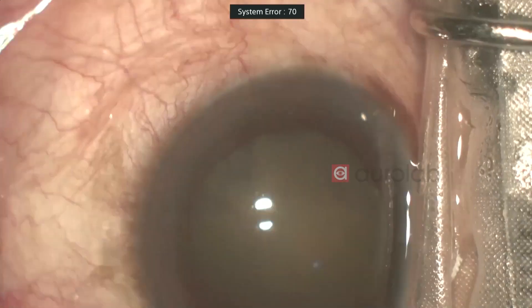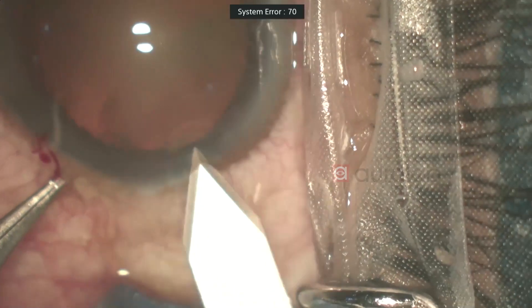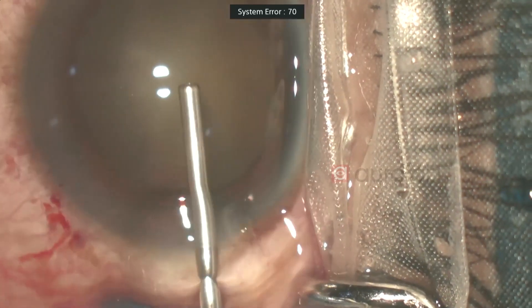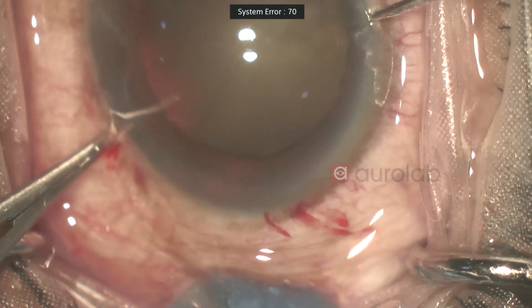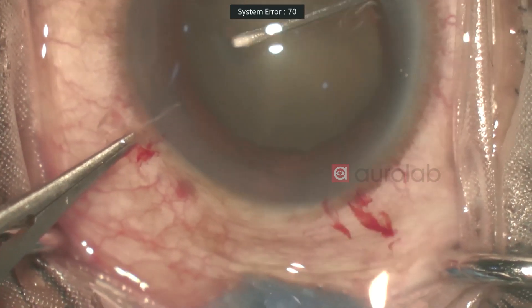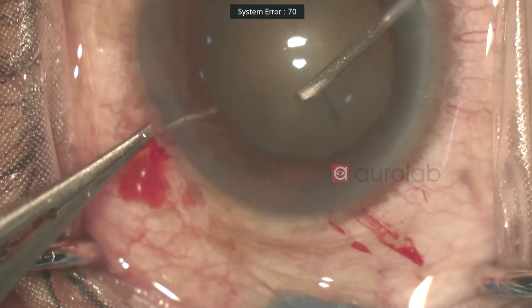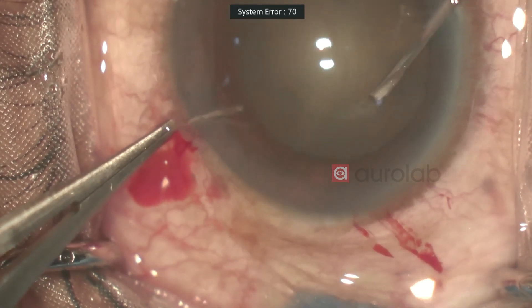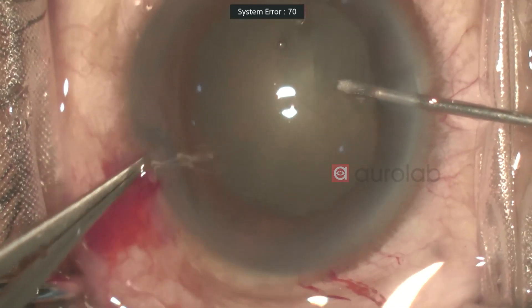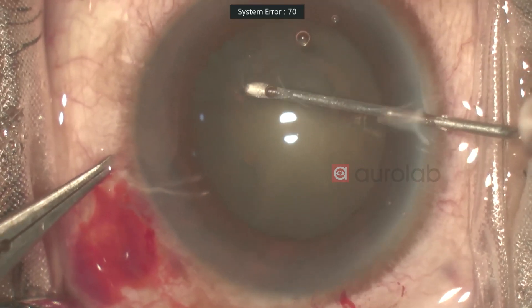I'm starting the surgery using AuroBlades. You'll constantly hear me saying that the patient has a lot of uprolling of the eyes. I'll go a little slow since she's moving a bit and I don't want to compromise on the size of my rhexis. Trying to make it around 5.5 mm — and yes, this is around 5.5 mm.